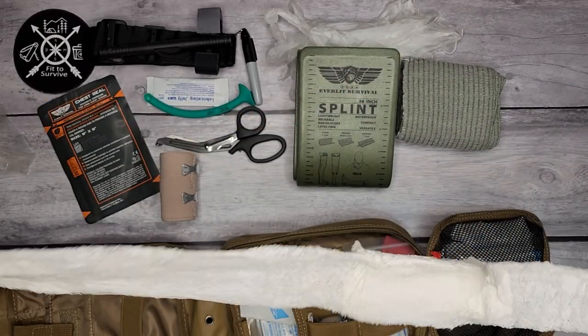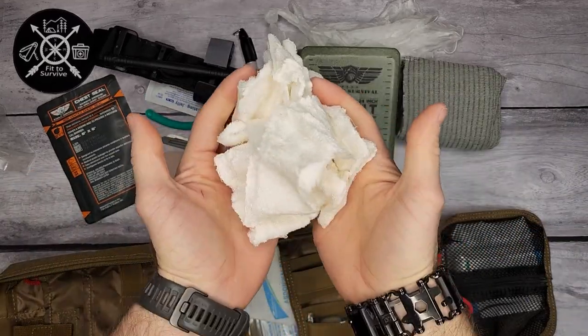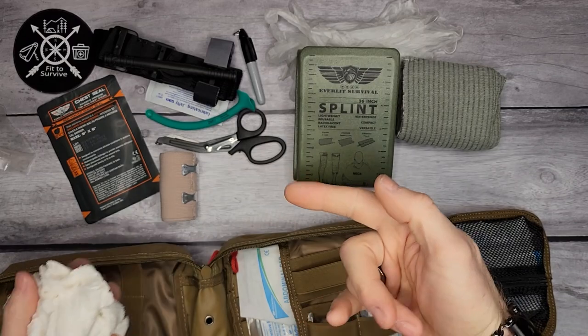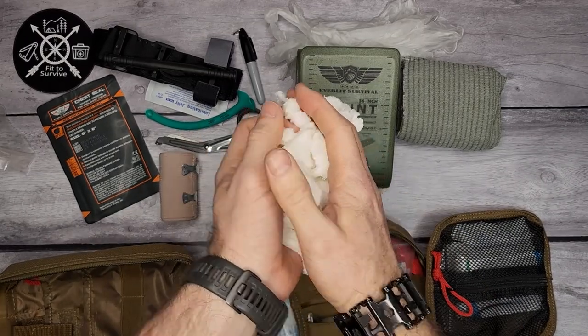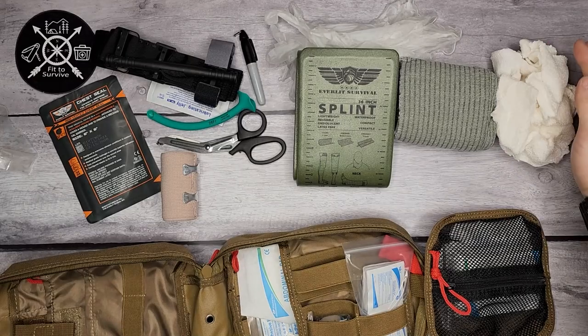Once you pull it all out, that's actually a whole lot of gauze. Being vacuumed down, it took up just a small little bit of space — that was their vacuum-packed gauze.